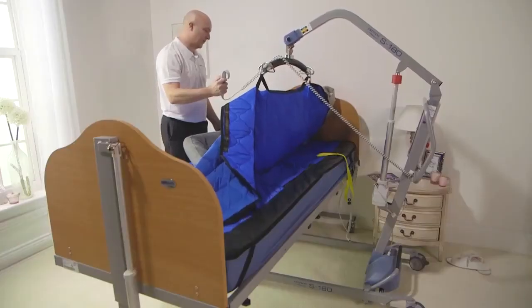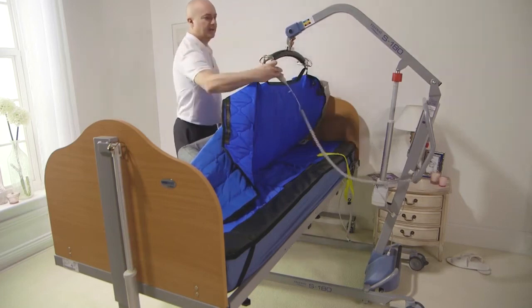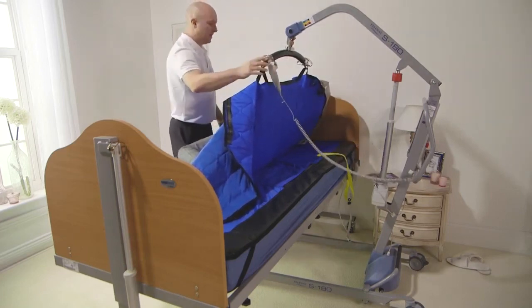The turn is being done using a freeway S180 mobile hoist, although this procedure can be carried out using an overhead tracking hoist or gantry system.